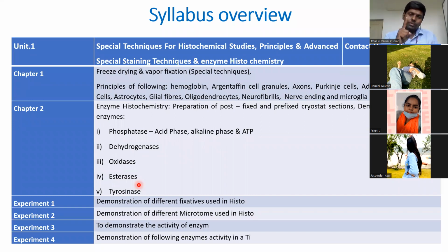So first I will give an enzyme blocker to the tissue. This blocker will temporarily stop the functioning of that enzyme. So that enzyme won't work in the pathway, it won't go here and there in the cell. It won't go to mitochondria, it won't go to ribosomes. It will stay in the cytoplasm only.